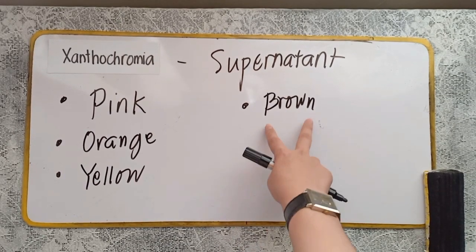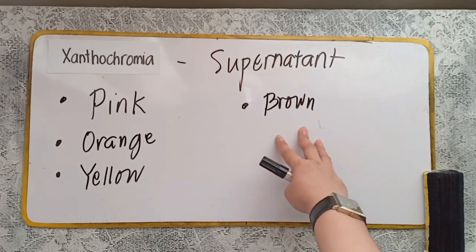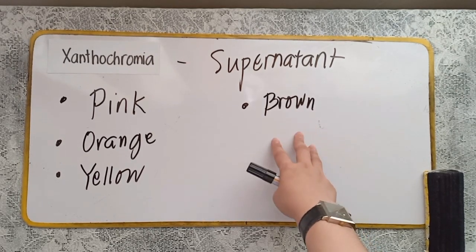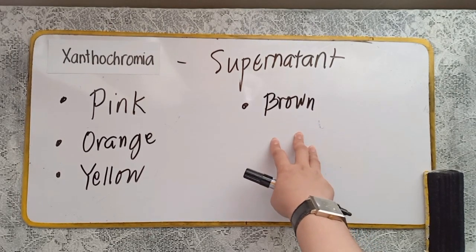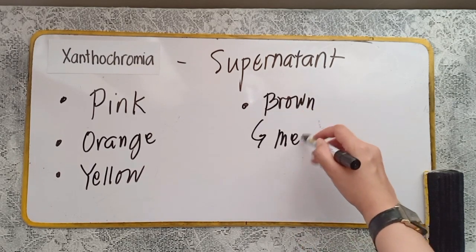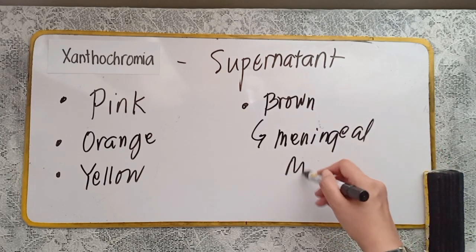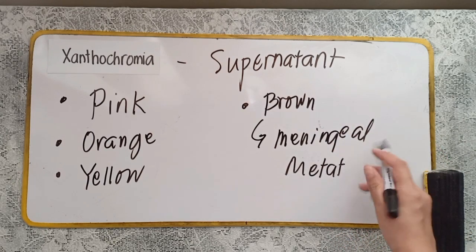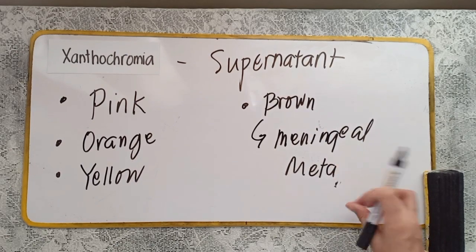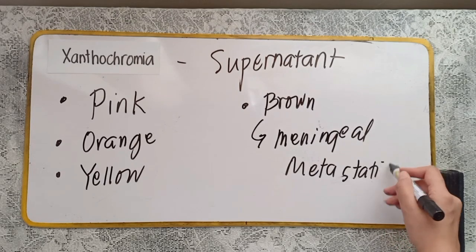By the way, class, a brown CSF sample, the xanthochromic brown sample, is indicative of meningeal metastatic melanoma. Again, meningeal metastatic melanoma.